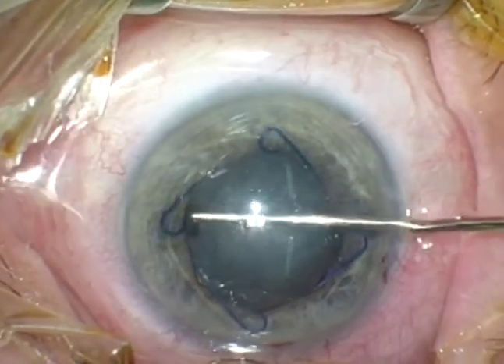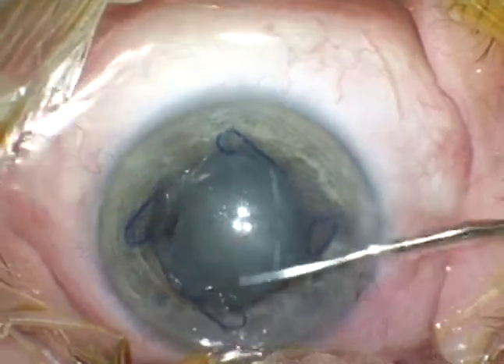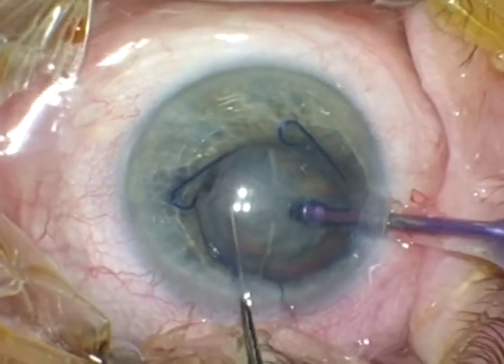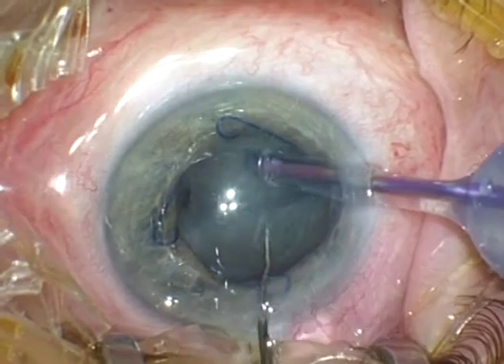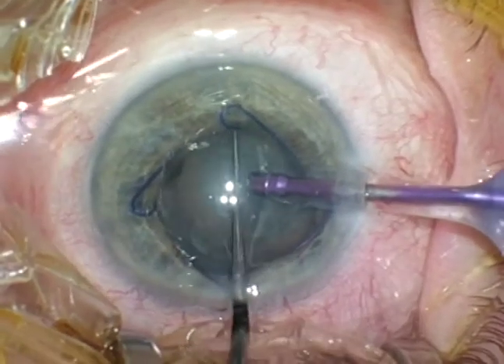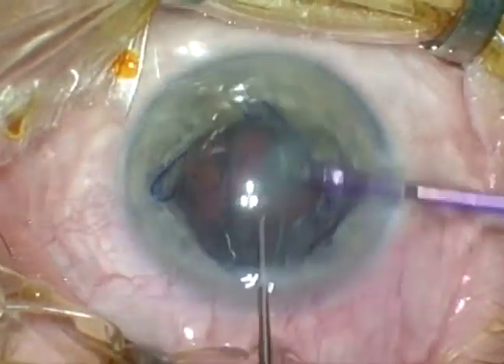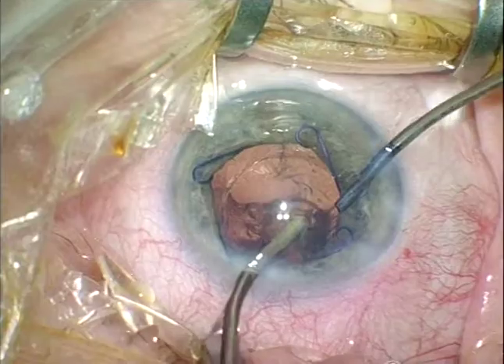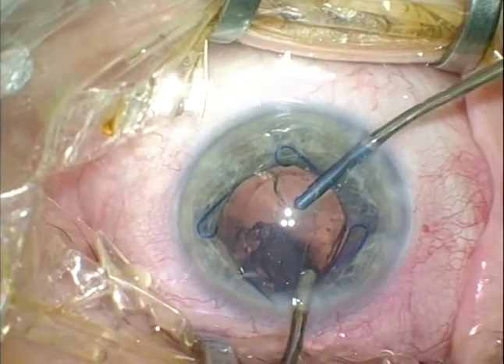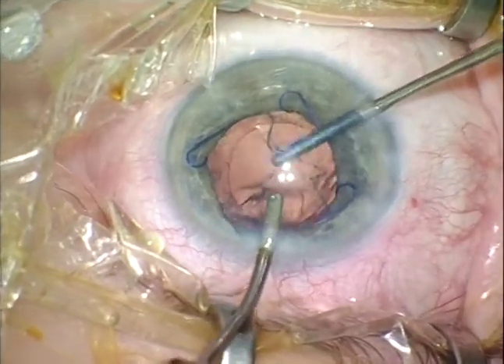And I have now disengaged this scroll in order to facilitate further steps of that procedure. Again, I'm checking now the mobility of the device, and it looks like it's moving freely, meaning that the placement of that device is correct. Phaco chop with the manipulation at the very center of the anterior chamber is my favorite because you're actually not going behind the iris and manipulating in the very center of the capsular bag. Bimanual irrigation aspiration is being done to evacuate the residual cortical material from the capsular bag.